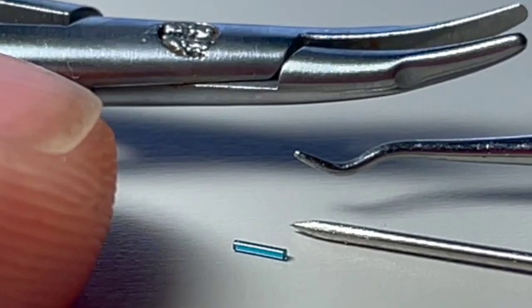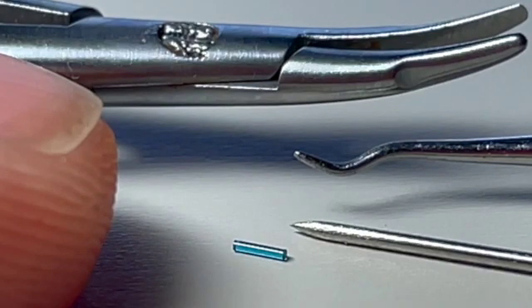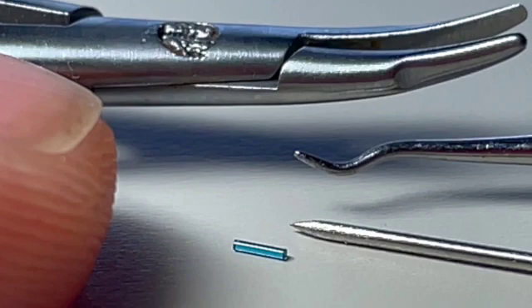Behind it is the tip of a small sewing needle, and above the needle is the punctal dilator, which is going to open the punctum. The largest thing displayed is my left pointer finger. The image is so zoomed in, you can see the minutiae, or dermal ridges, aka the fingerprint. And finally, behind my finger, you can see the locking needle holder. This will be used to put the plug in the punctum after using the punctal dilator.